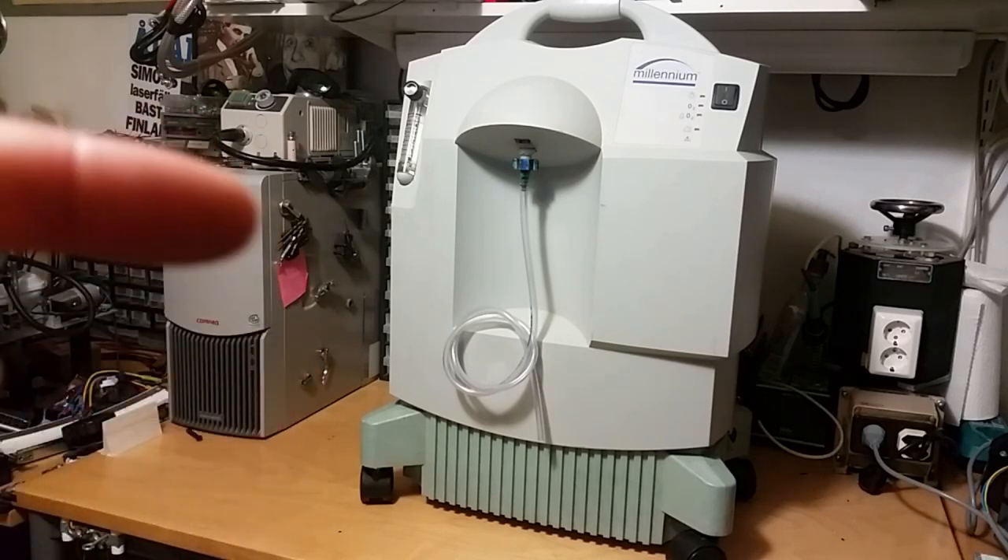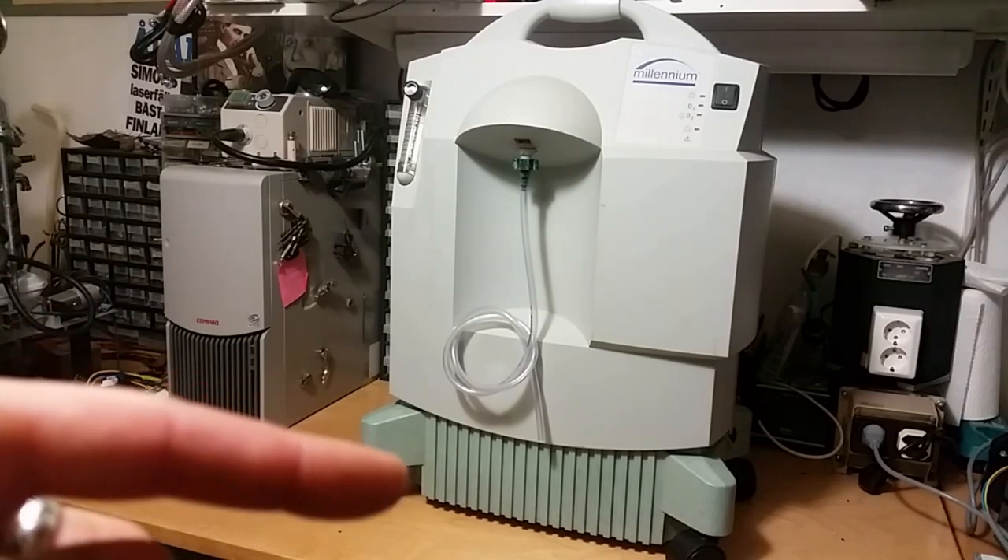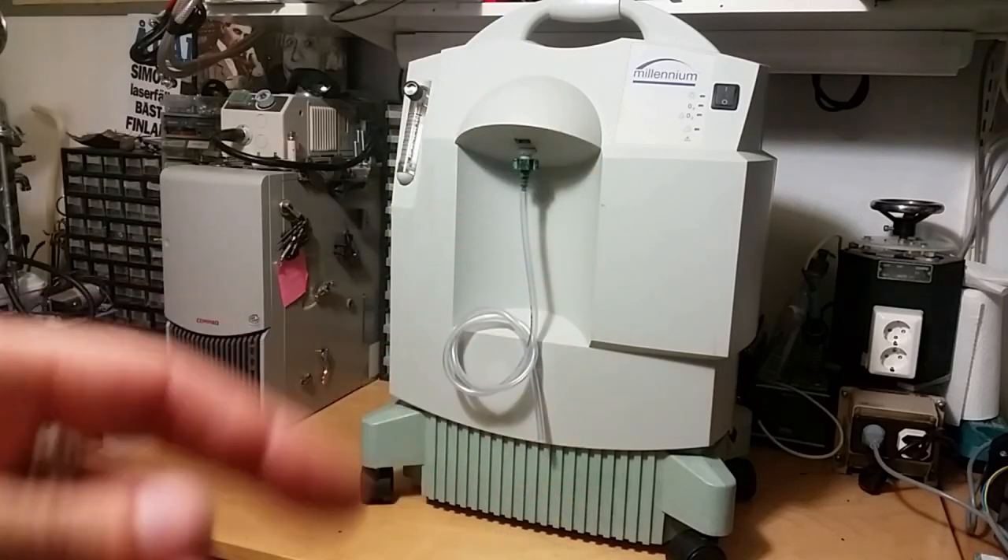The hospital did throw out two of these oxygen concentrators. I took home this one, and the other one I took apart in small pieces and took home as well. It's still operational — I didn't throw out anything, I just removed all the plastic casing.